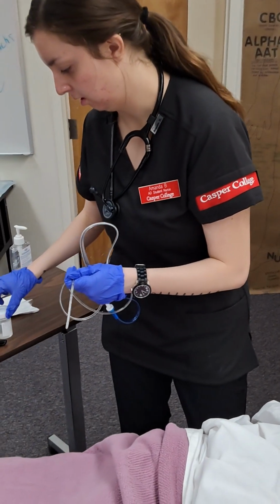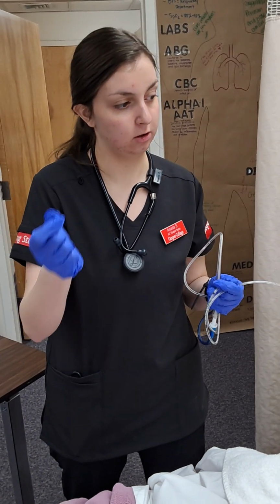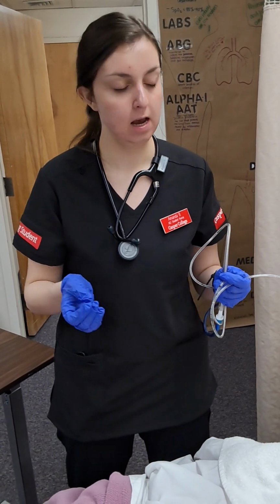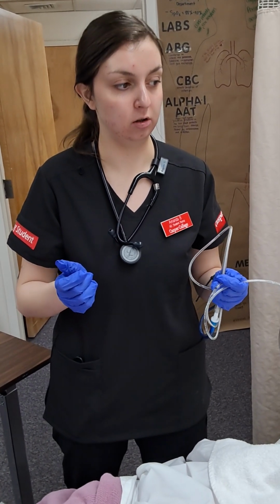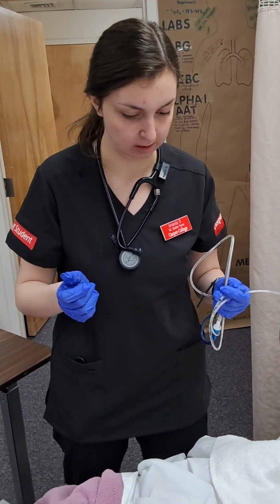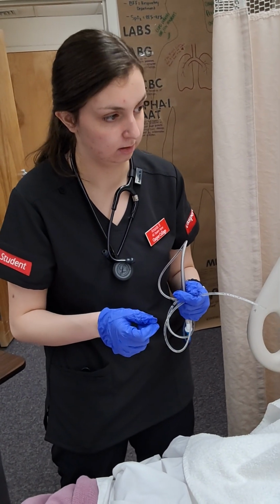and I will educate him. So when I first insert the tube, I'm going to have your head in a neutral position, just laying straight. And then once I advance the tube further, I will instruct you to bring your head towards your knees, and I'll have you sip from the straw. It's just water. I'll just have you sip the water from the straw, and that'll help bring the tubing into your esophagus. Okay.